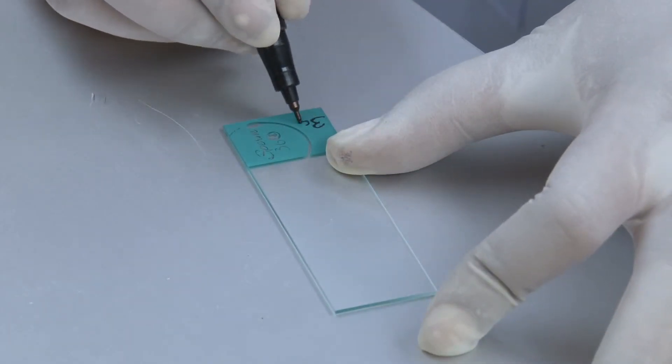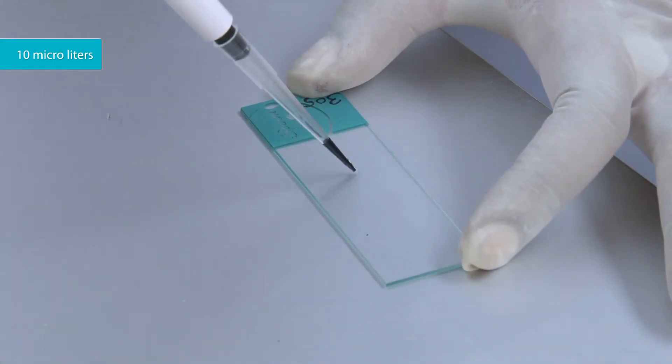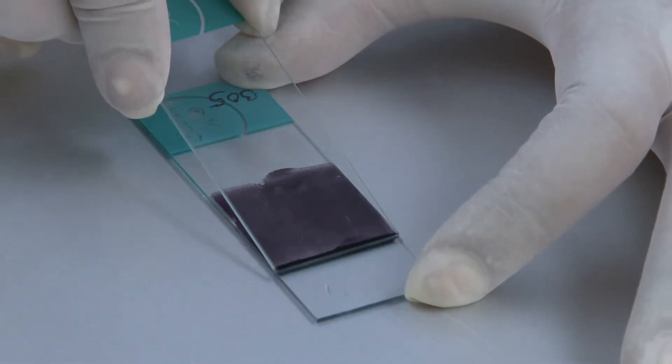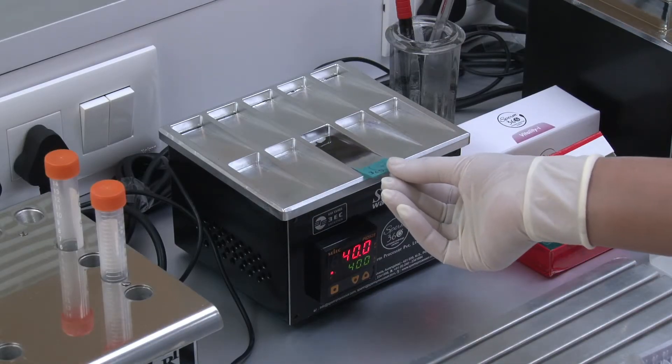Label the slide with ID. Place 10 microliters of the mixture and prepare a smear. Keep the slide on the slide warmer to dry.